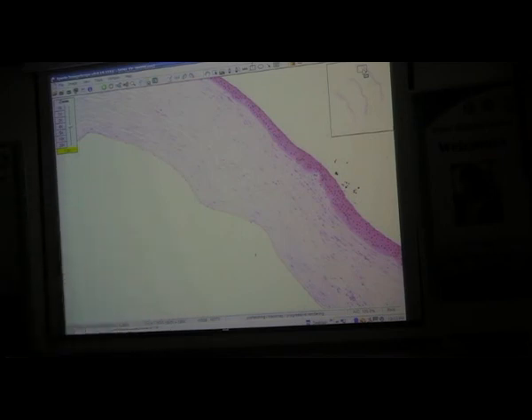In a penetrating keratoplasty, at the moment that you go through Descemet's membrane, do you see aqueous spurting out into the surgical field? Typically not. You enter the anterior chamber, you don't see very much at all. What's the reason for this? So if the cornea is dehydrated, and you perforate the cornea focally, the corneal stroma swells and seals the wound.